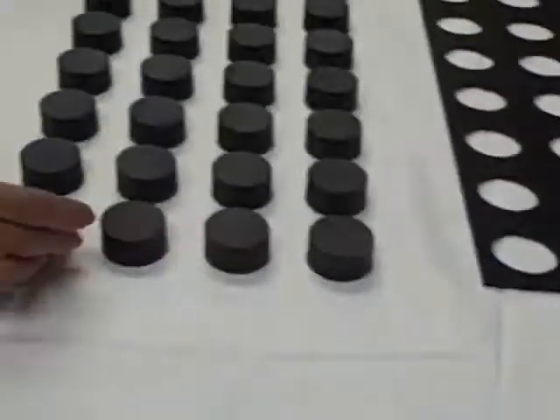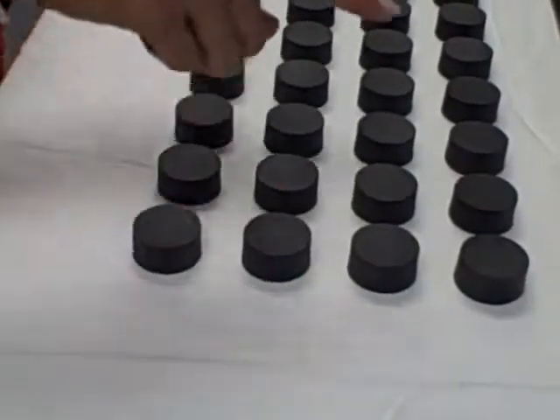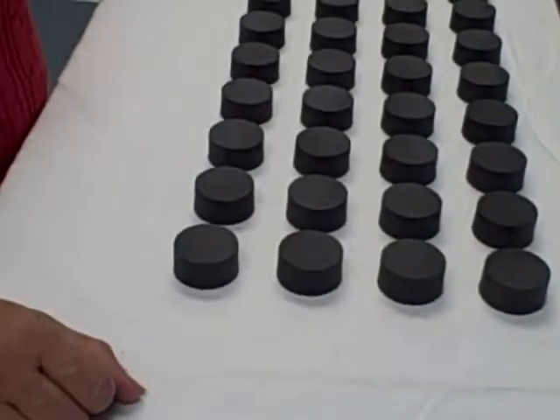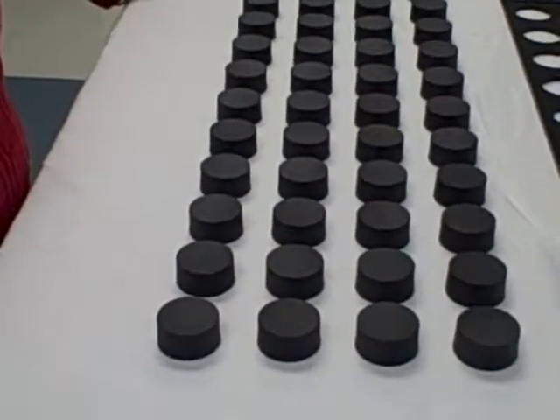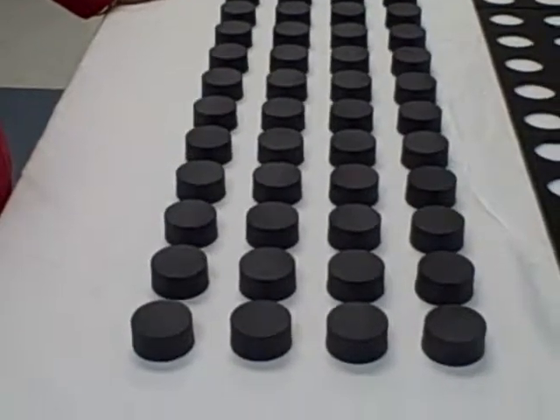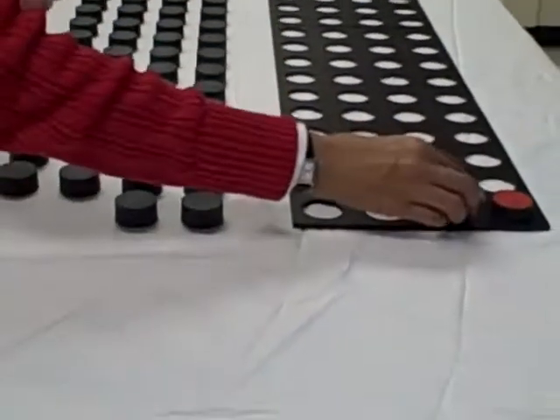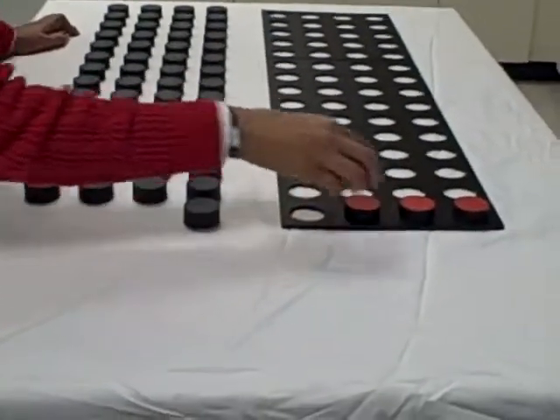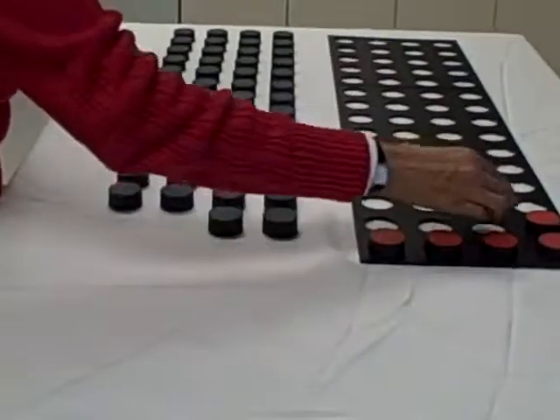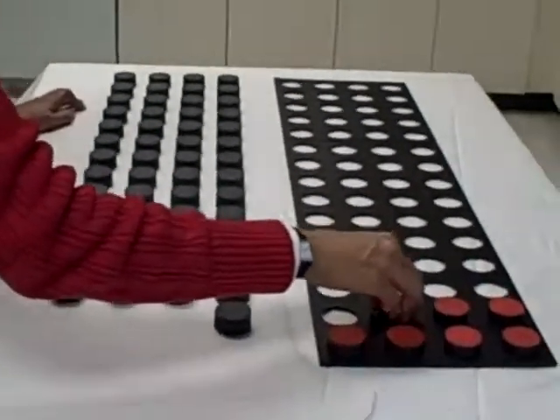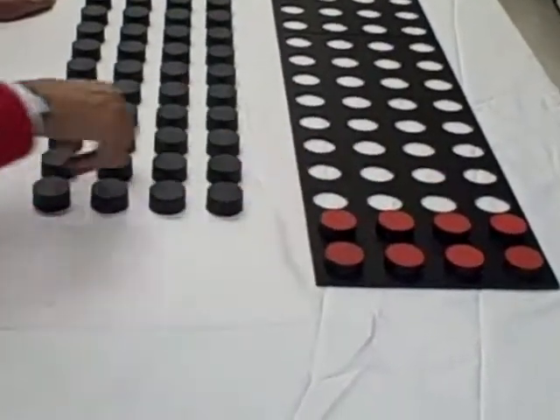So you would go starting with the bottom peg into the top hole. Okay. So directions are, begin on your right, put the bottom block in the top hole, bottom side up. So that was how the person would move through that.